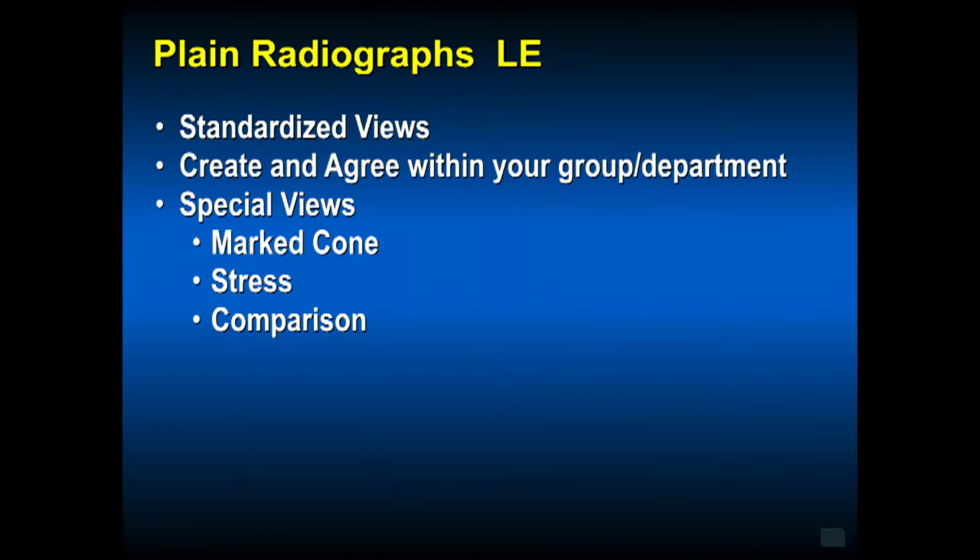Plain radiographs in the lower extremity. If you can get your partners or clinic or department to do standardized views, this is very helpful so that you can compare them year to year. Create and agree within your group or department about these views: special views, marked cone views, stress views, and comparison views.